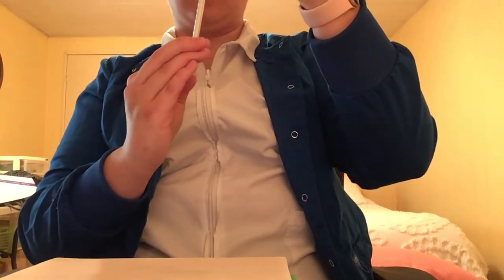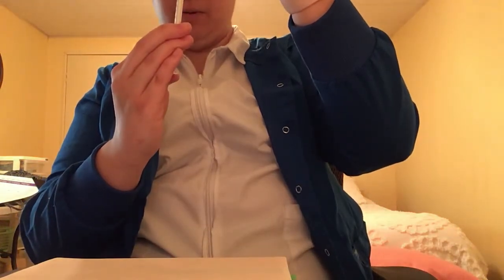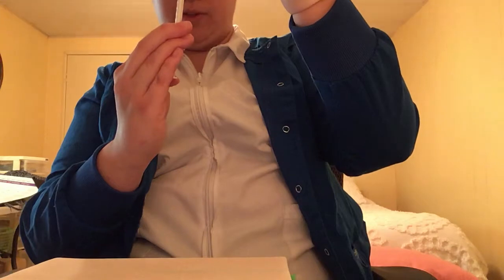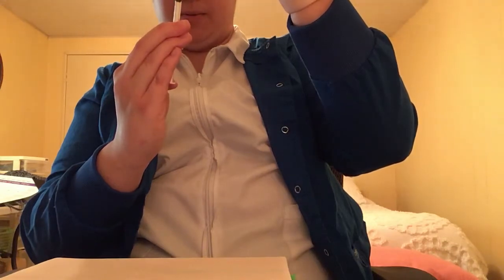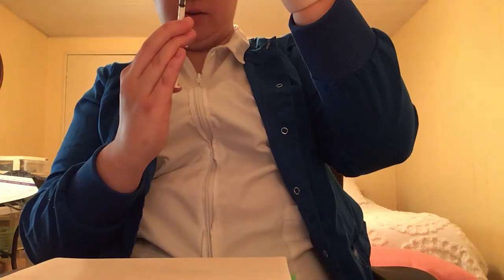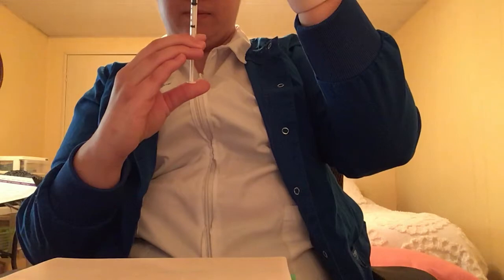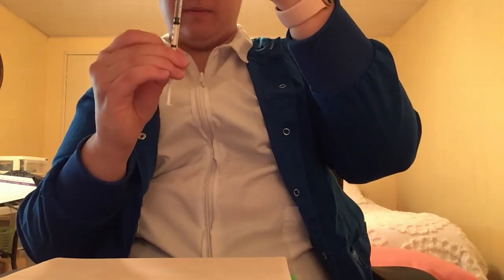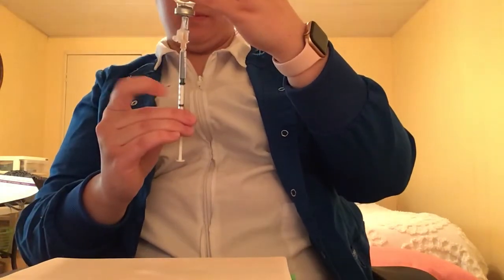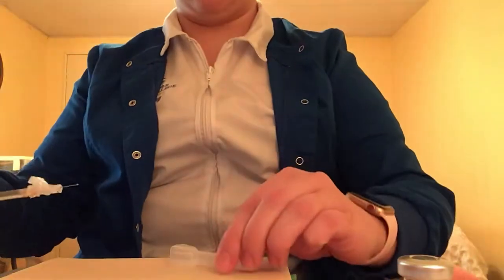And on the first syringe, I did not have any air bubbles, but this one I do have an air bubble. So I would just withdraw a little bit more than needed so that way I can get rid of that air bubble. At 0.5, I'm going to do a little bit more. Okay, there are currently no air bubbles. So I'm going to reverse and withdraw, and I'm going to passively recap my needle.